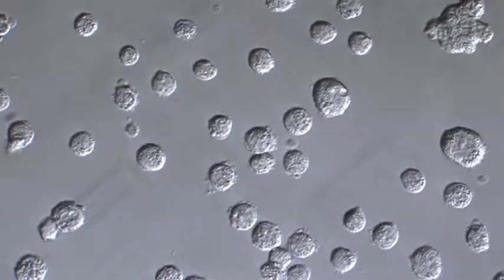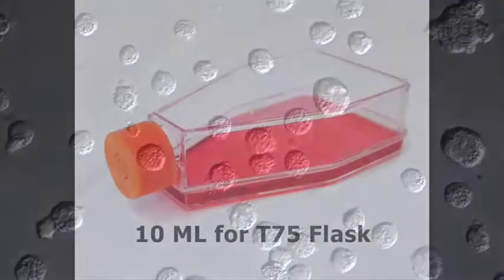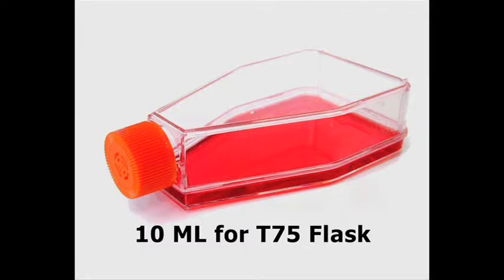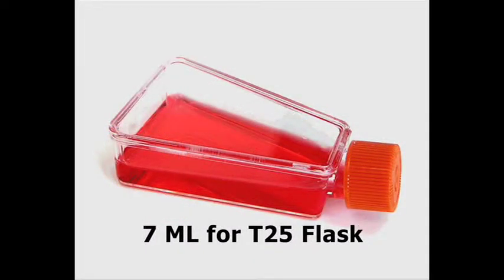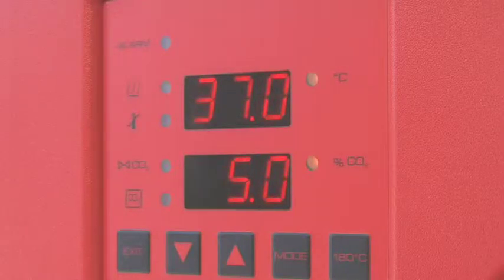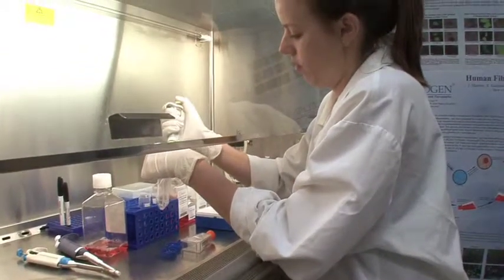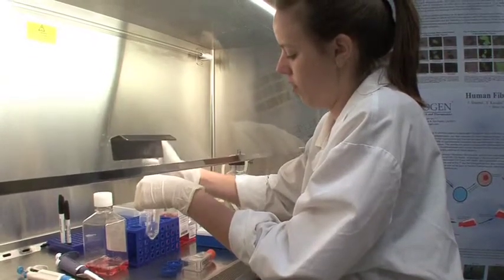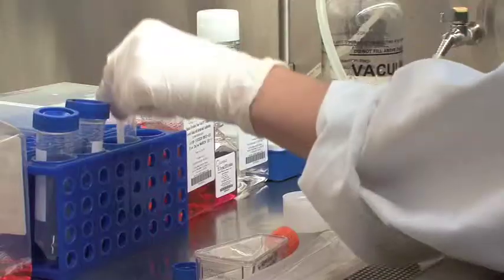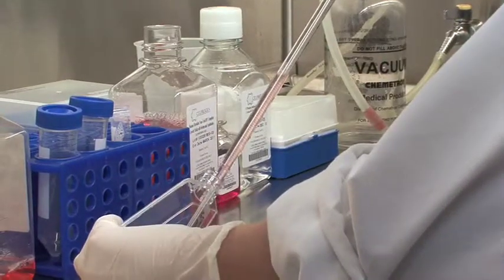Please note, if the suspension cell density is low, combine with the attached cell pellet into a total volume of approximately 10 milliliters per T75 flask or approximately 7 milliliters per T25 flask. Incubate at 37 degrees Celsius 5% CO2 in a humidified incubator. After 24 hours of plating, inspect the cells. In the T25 protocol, if the cell density is high, plate the cell pellet into 2 T25 flasks for a 1-to-2 split. This concludes the seeding protocol for plated T75 and T25 flasks.